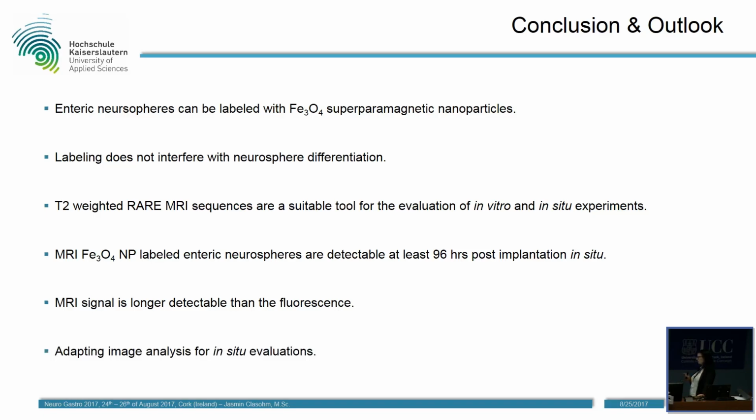What we need to do further is, of course, adapt the image analysis or the quantification method for the in situ samples.